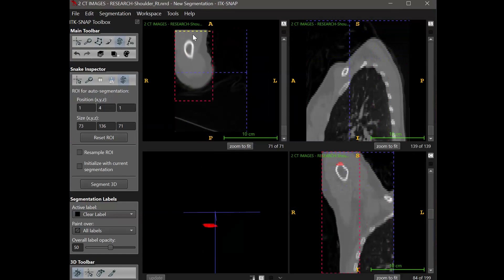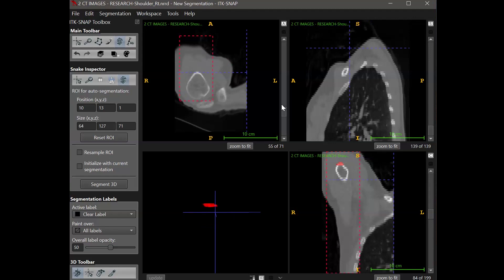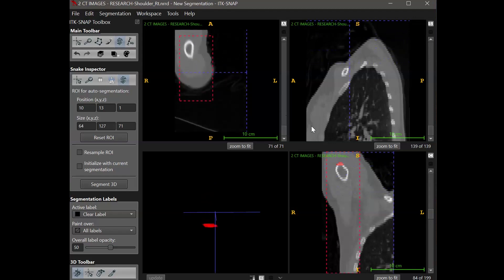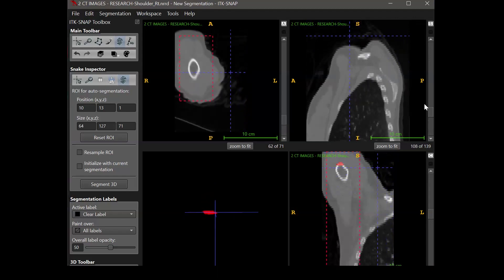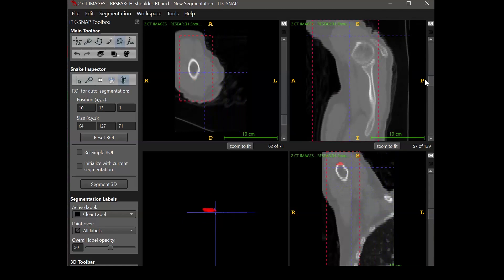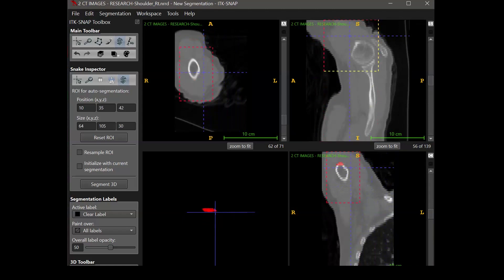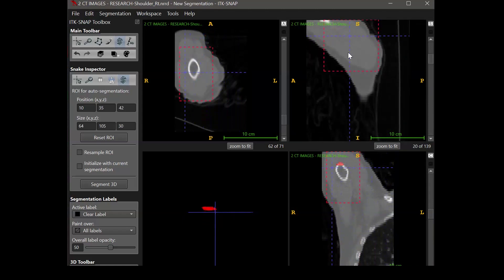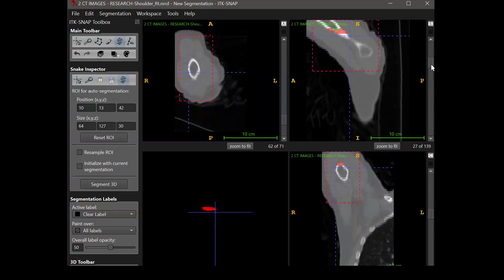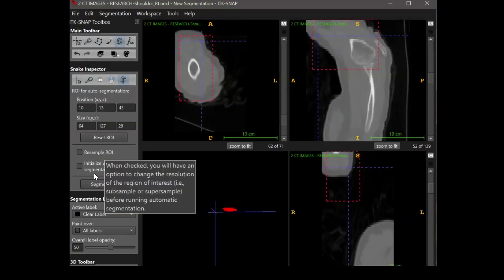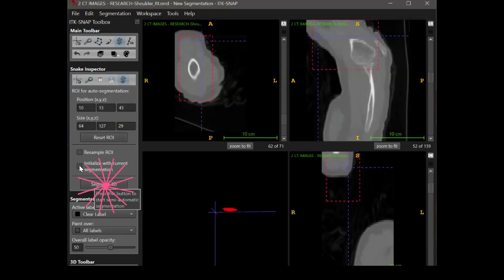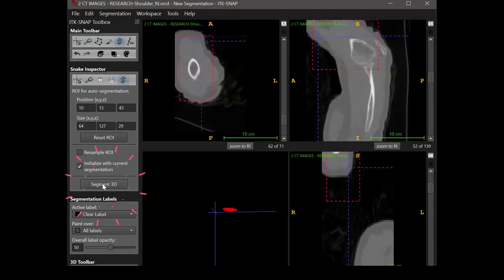Check each view to ensure that you aren't cutting off any part of the anatomical feature you're trying to isolate. But at the same time, you do want to make sure that the ROI is as small as possible to cut down on computational time. After you have adjusted your ROI boxes, you can click the Segment 3D button.